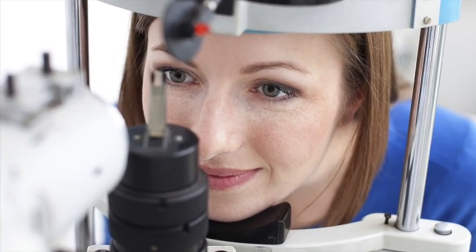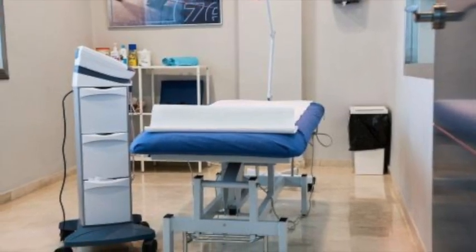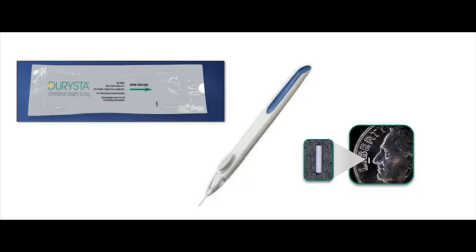This can be done at the slit lamp or as a minor procedure in a supine position. The device is preloaded and after insertion in the anterior chamber, it is released with a click of a button.